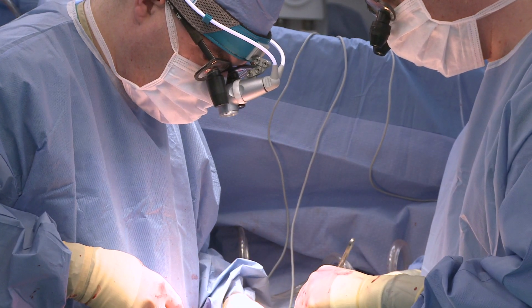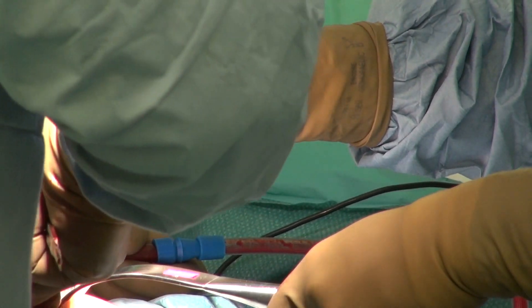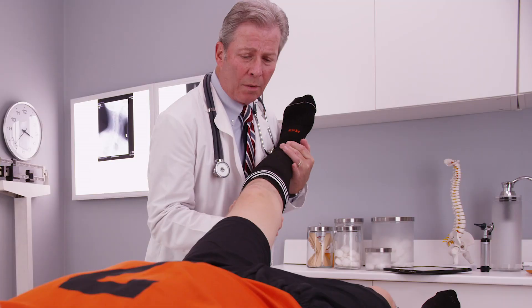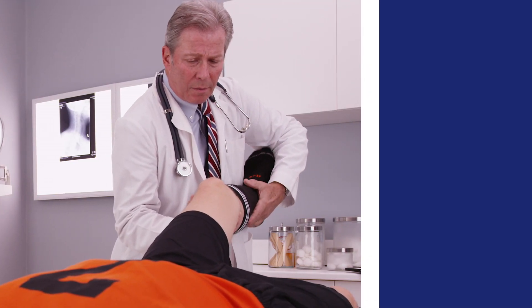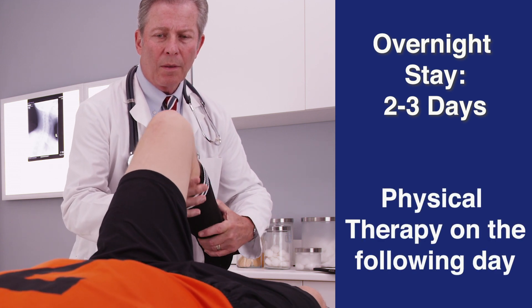The surgeon then closes the joint capsule and repositions the muscles. The surgeon may place a drain in the hip to remove excess fluid and close the incision with stitches or staples. After completion, patients can expect to stay overnight in the hospital for two to three days, typically starting physical therapy the day following surgery.